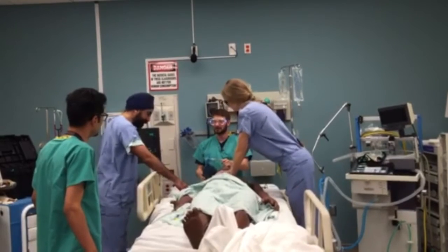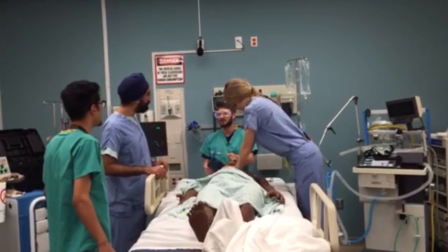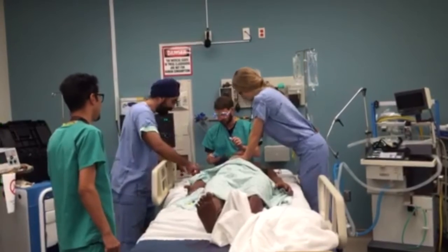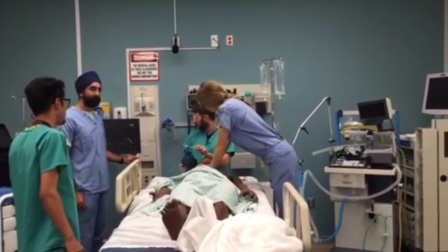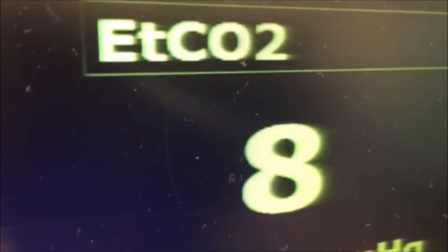Do we actually need an end-tidal CO2? I'm pretty sure I got it. I saw cords. He's got this. This was an easy one, Doctor. Dr. Calrissian, we need to use the end-tidal CO2 to confirm placement. Alright, let's confirm tube placement. Alright. End-tidal CO2 being attached. We have an end-tidal CO2.